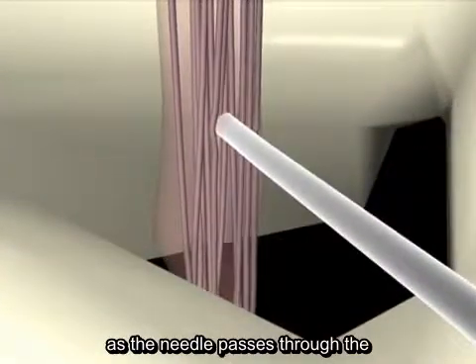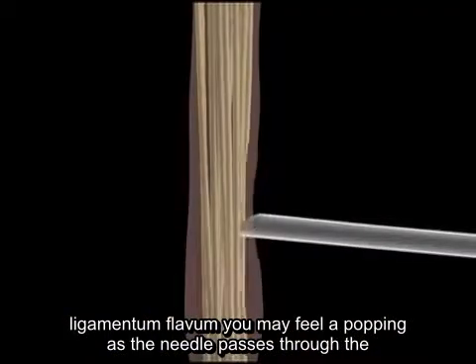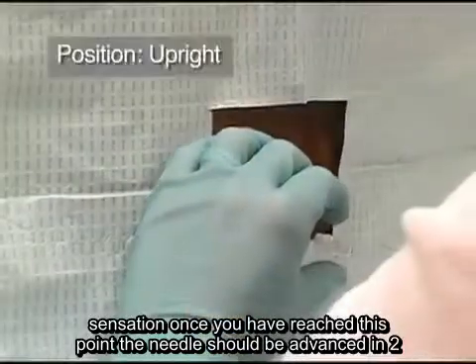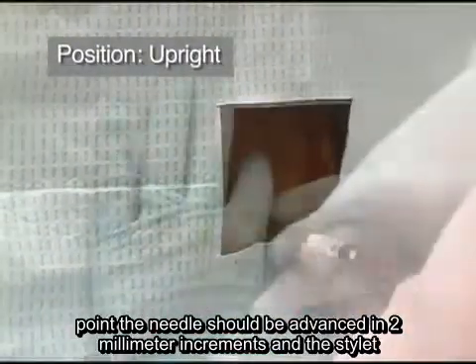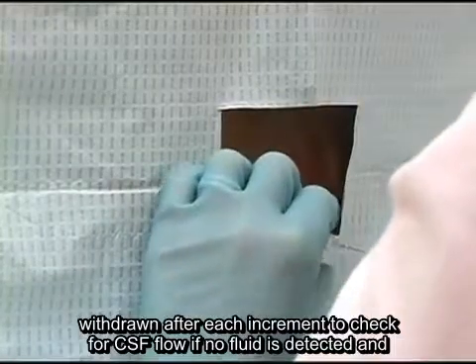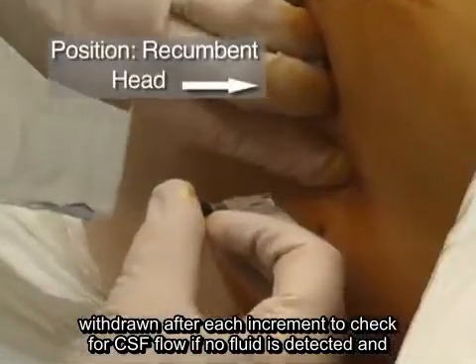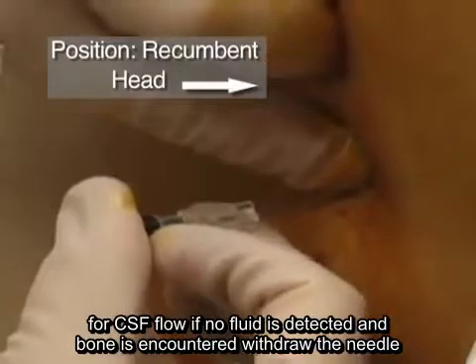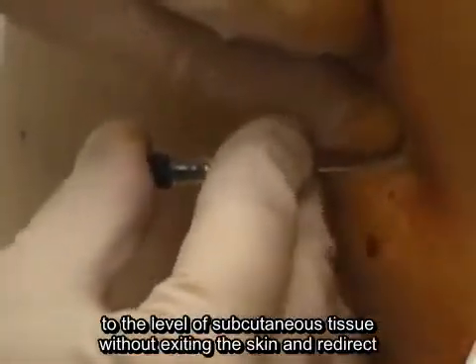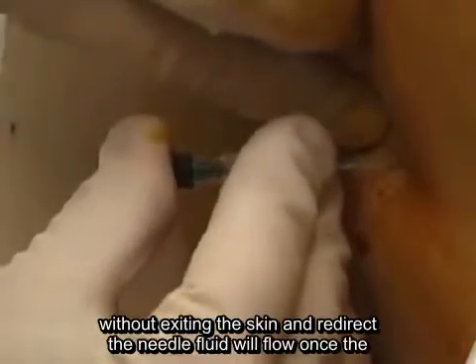As the needle passes through the ligamentum flavum, you may feel a popping sensation. Once you have reached this point, the needle should be advanced in 2 mm increments and the stylet withdrawn after each increment to check for CSF flow. If no fluid is detected and bone is encountered, withdraw the needle to the level of subcutaneous tissue without exiting the skin and redirect the needle.